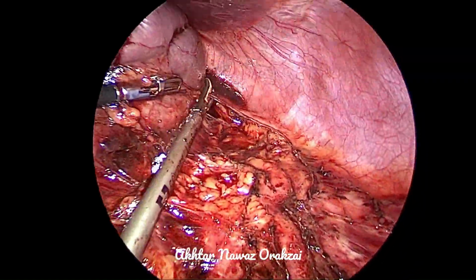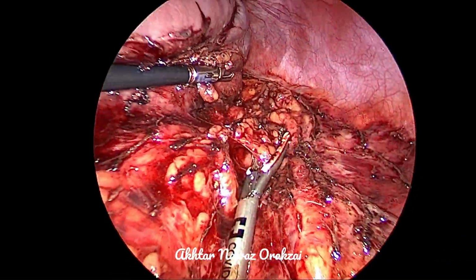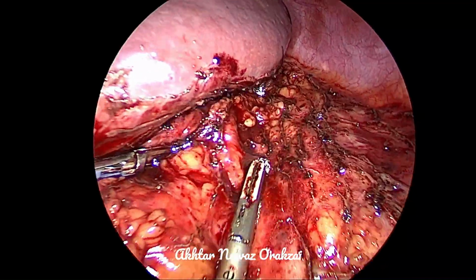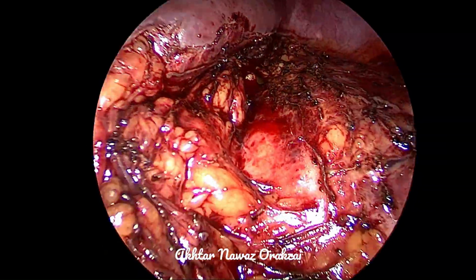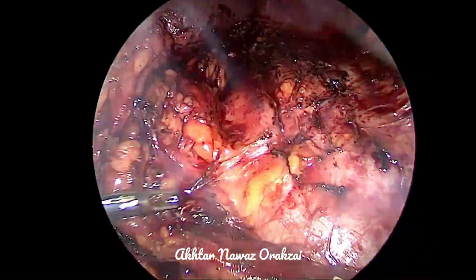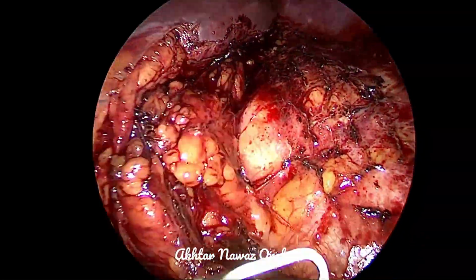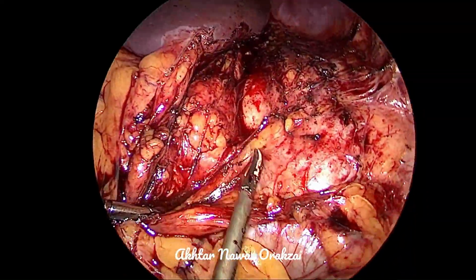Managing the diaphragm injury can be done laparoscopically. We can repair the diaphragm at the end of the procedure with Prolene and have a chest tube inside, and the chest tube can be removed on the first or the second post-op day.